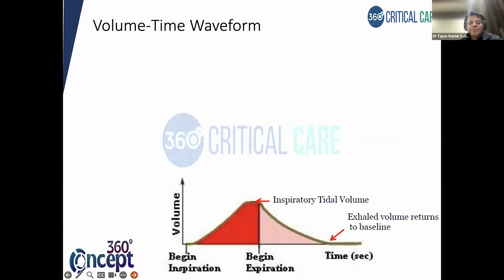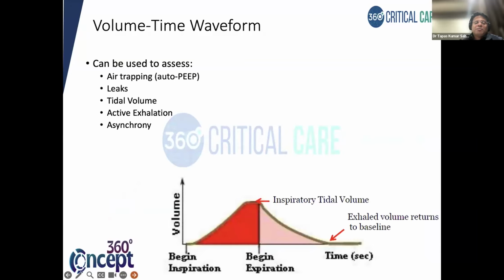Okay, now coming to the volume time waveform. What is the utility of the volume time waveform? This can be used to assess air trapping. Again, we can get the air trapping, auto PEEP. Leaks, that is most important here. Knowing the tidal volume, active expiration and asynchrony.